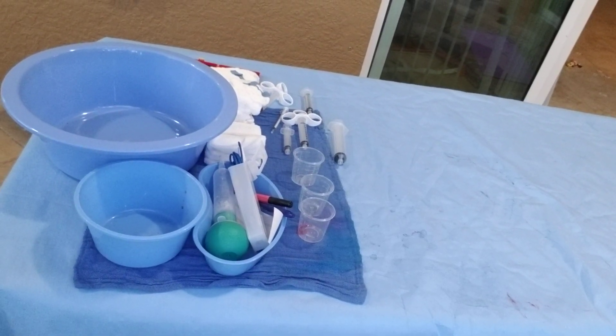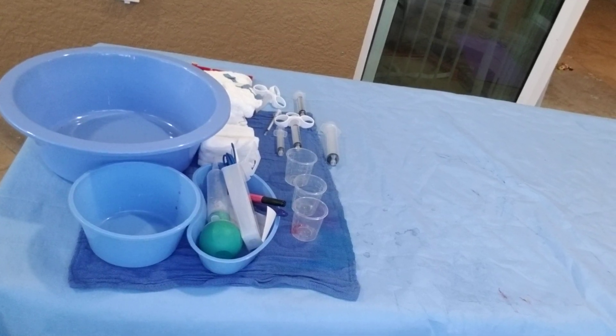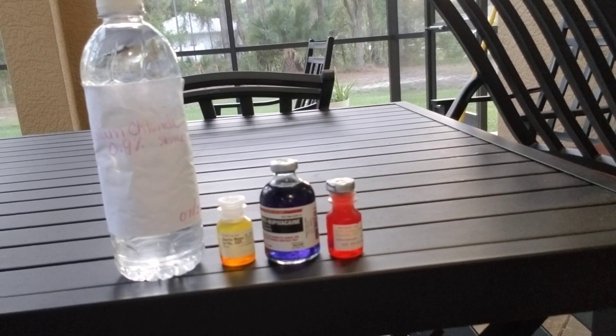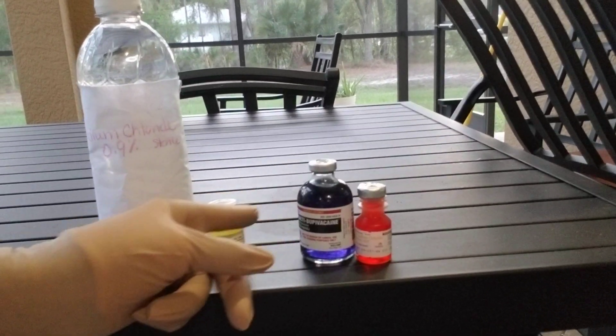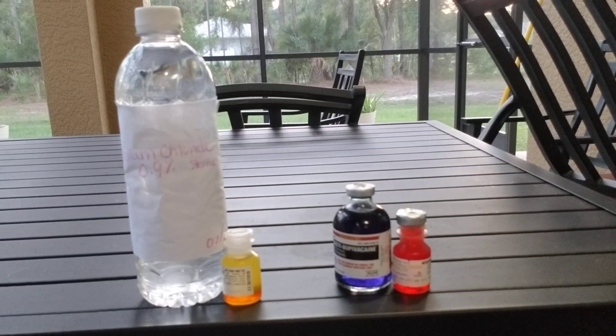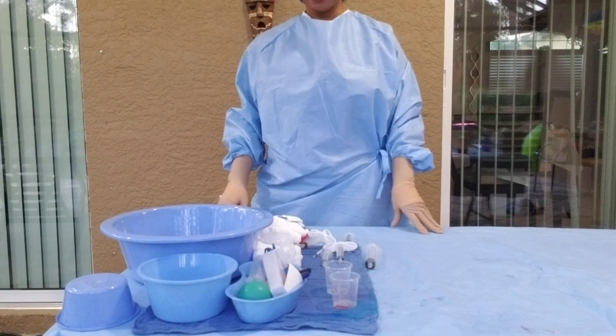Today we're going to be going over labeling, preparing, and passing medication. For video purposes I have them color-coded so you can see them — normally they are clear solutions.